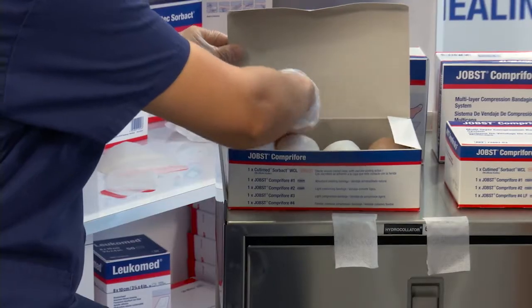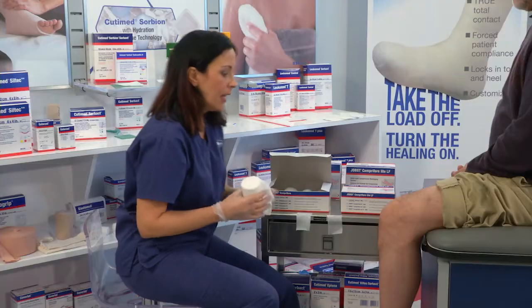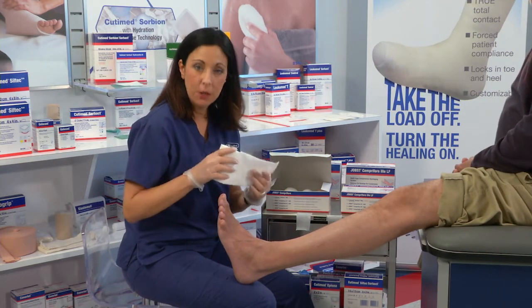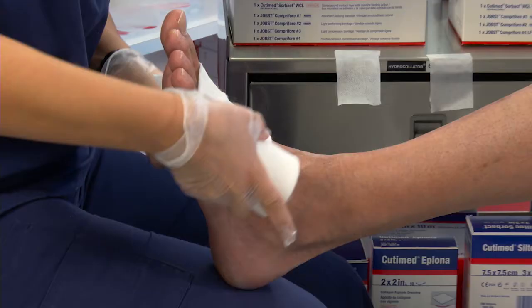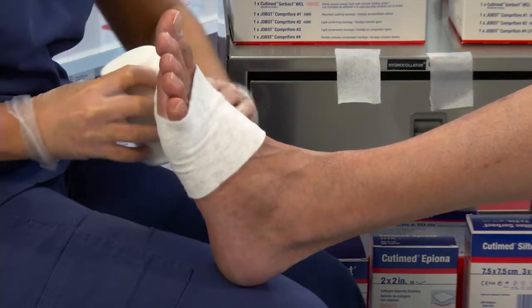Before I get started, I make sure that I have my tape ready to adhere to the bandage and I have my patient positioned at a 90 degree angle. Layer number one is a viscose padding. This is meant to pad the leg and wick up moisture and exudate. We're going to start by applying at the base of the toes and anchoring twice around.